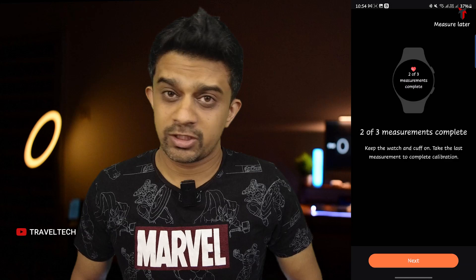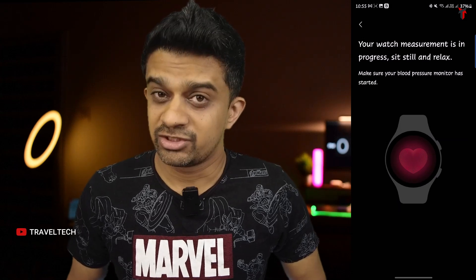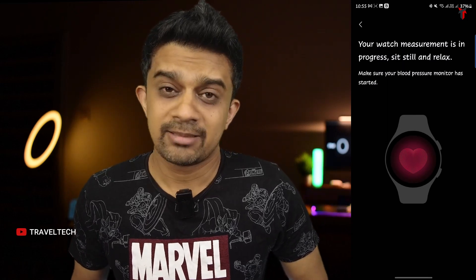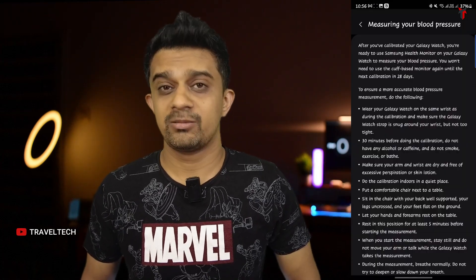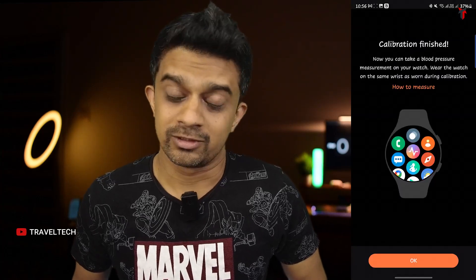If you want to check someone else's blood pressure, you need to recalibrate the smartwatch for that person — you can't just measure anyone else's BP freely. Additionally, Samsung recommends recalibrating every 28 days, or once a month. Calibrating once doesn't last a lifetime; you need to recalibrate monthly to maintain accurate readings.